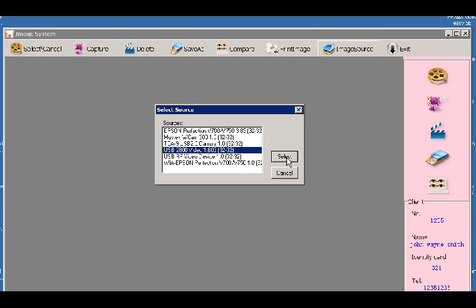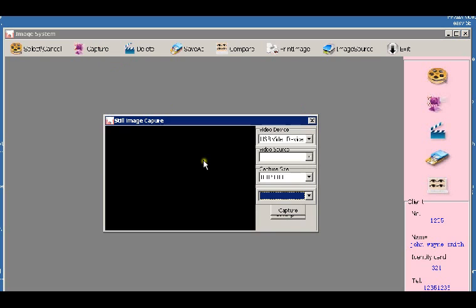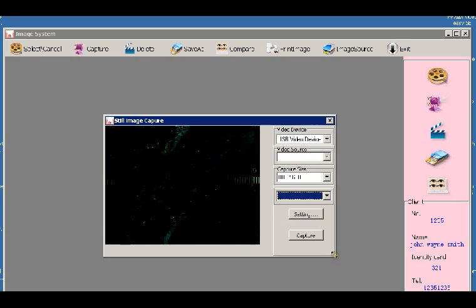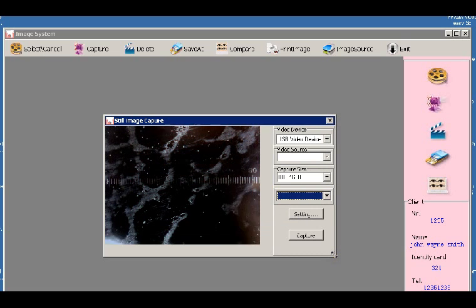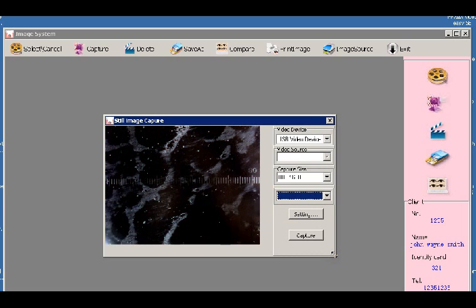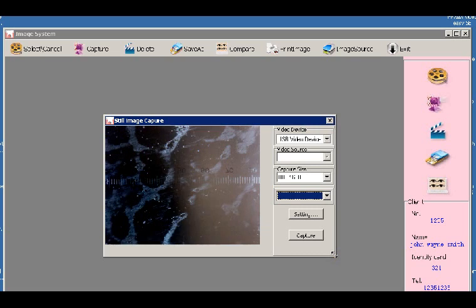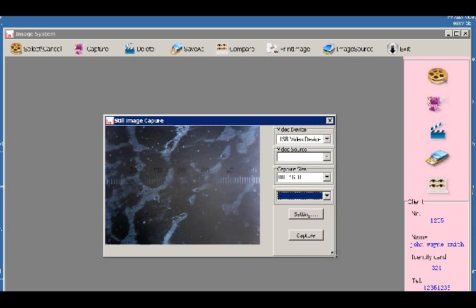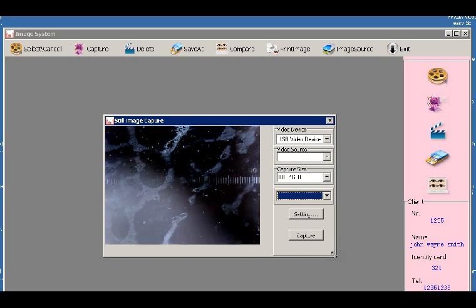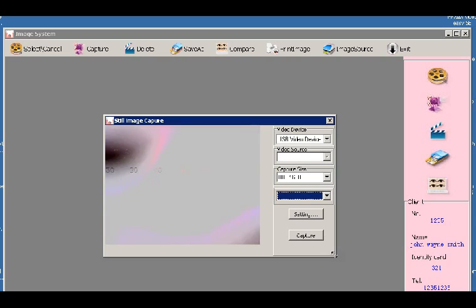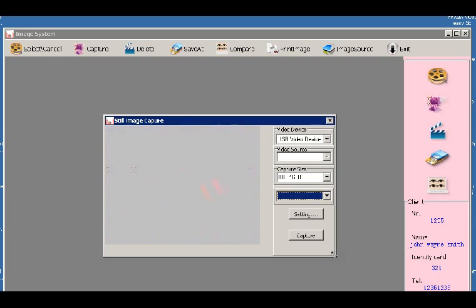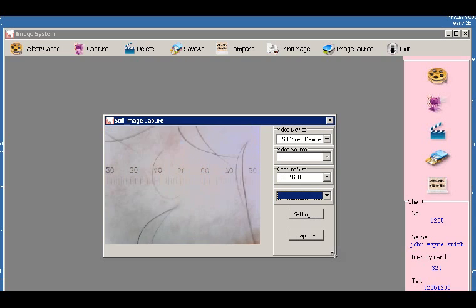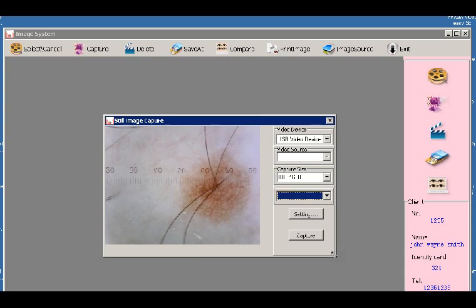Click select and what I'm going to do then is click the capture button. This will bring up a live image of the actual device. I'm just using it with a little epiluminescence or gel-based viewer. I'm just going to grab an image here.